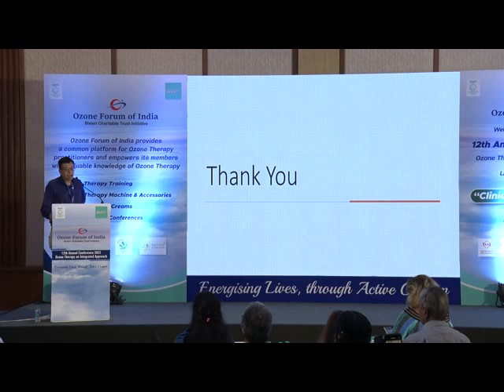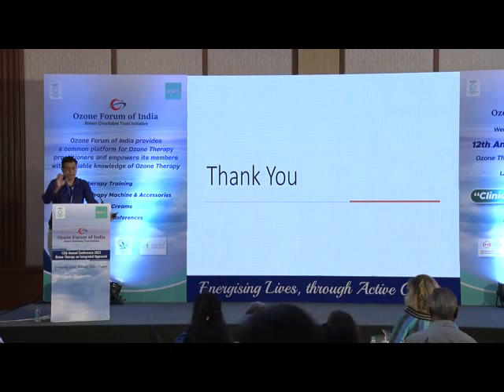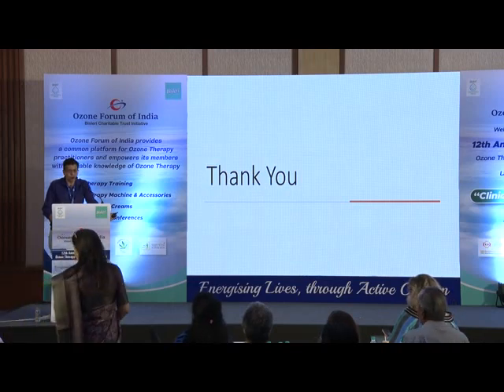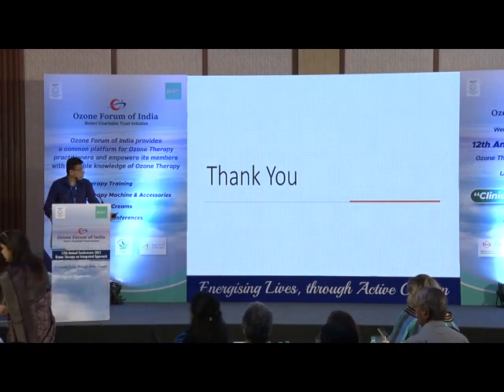So I also have excimer laser along with the narrowband. We also have excimer lasers. Excimer laser got very good results in management of vitiligo, especially small area of patches. So this is one special laser, excimer laser. And we can use narrowband UV phototherapy also for the vitiligo patient.